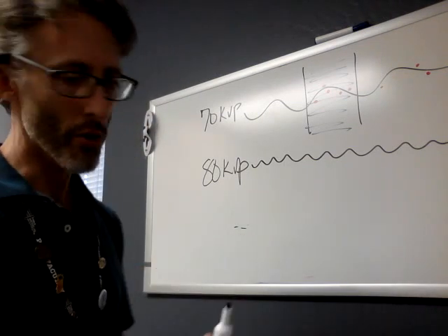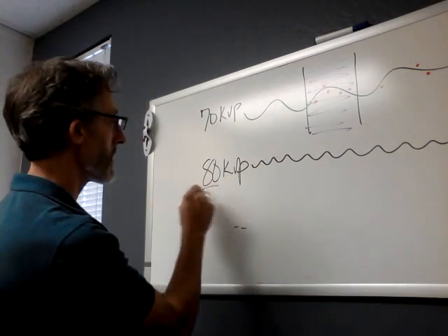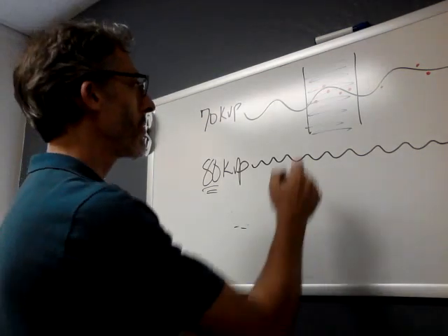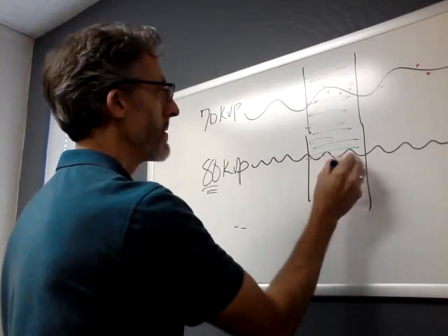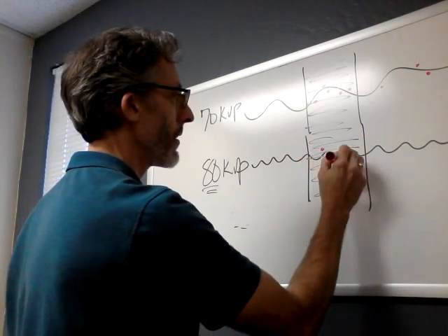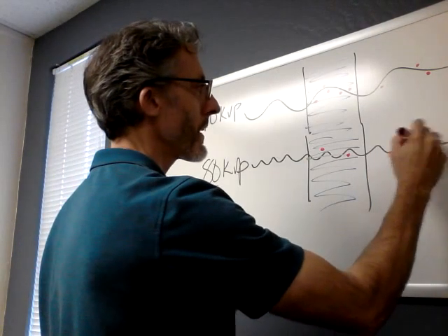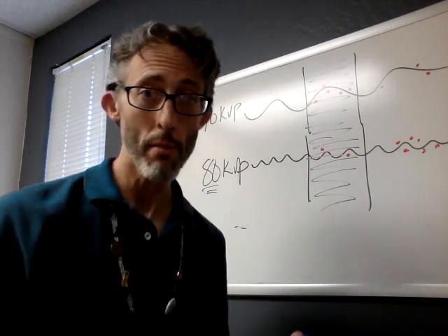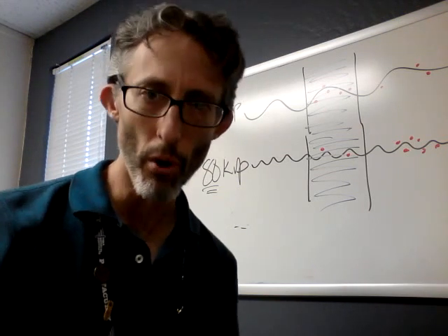So let's continue with our little picture and see if it makes sense. Once we've increased the kVp by 15%, we have a more energetic beam overall. What that's going to allow to happen is, let's just draw our patient tissues again. We're going to have fewer photons being absorbed in the body and more photons making it all the way out the other side. So we have more photons reaching the image receptor, which is what we needed all along. The image receptor was underexposed.